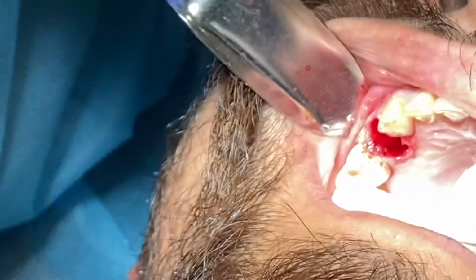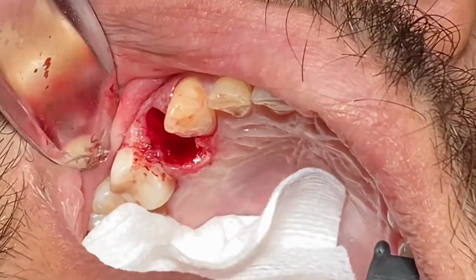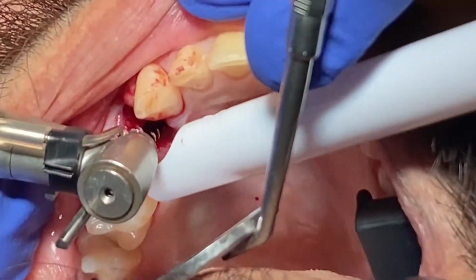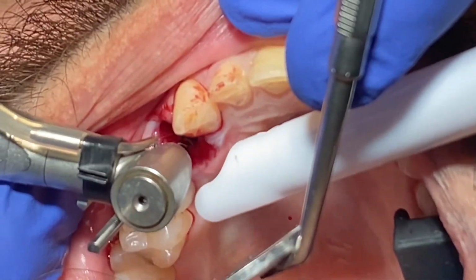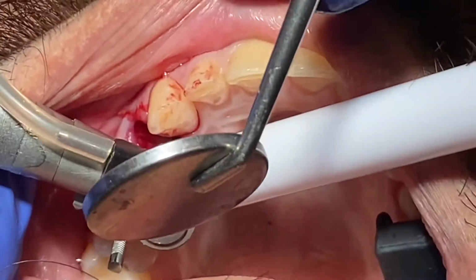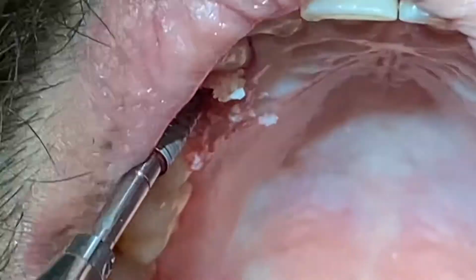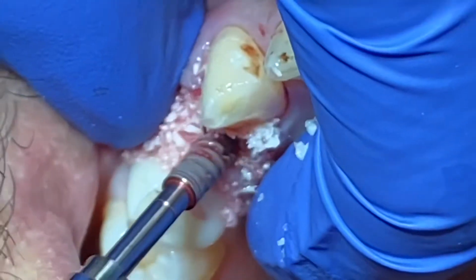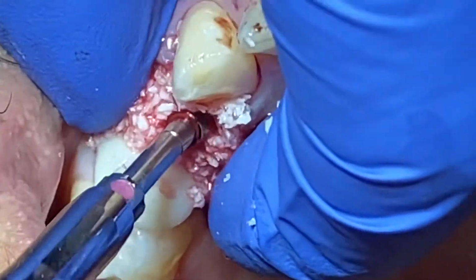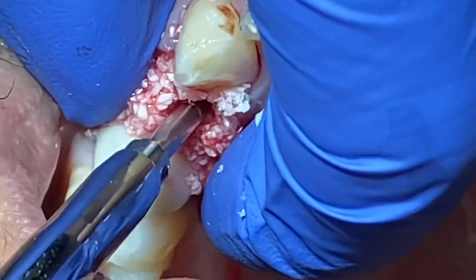So the tooth is being removed, and you see the big root resorption at the junction at the middle part of the root surface. The patient was receiving at least 2-3 consultations from UC, SF, and UOP, and they both agree that the tooth should be coming out. So he came to me, and we decided to go ahead and try to preserve the bone area because we don't want to lose any type of bone and gum tissue, because it's quite close to the aesthetic zone area at his smile.